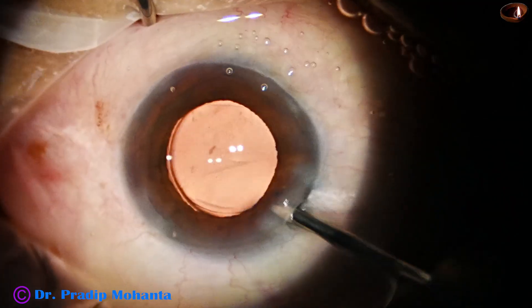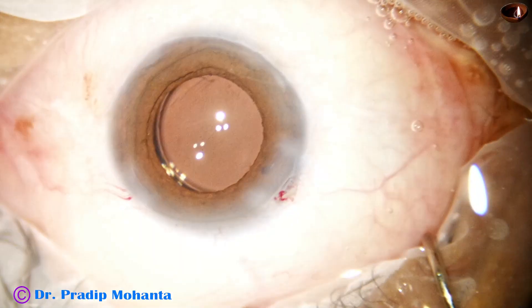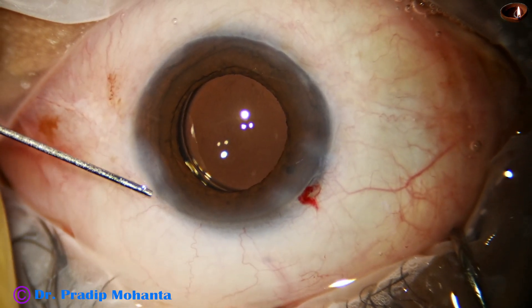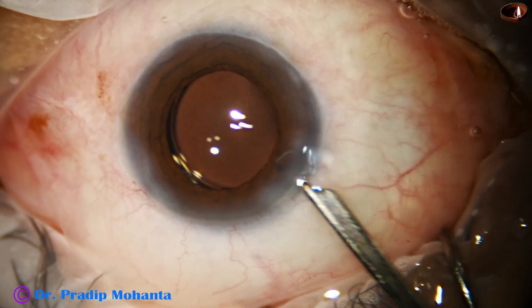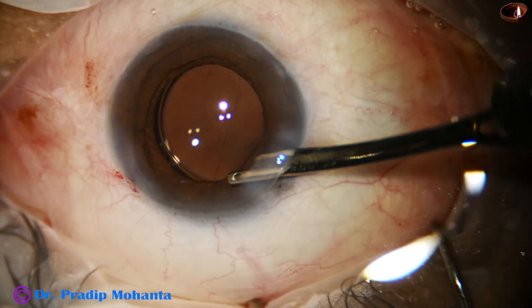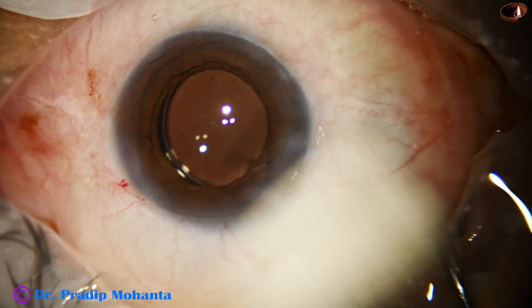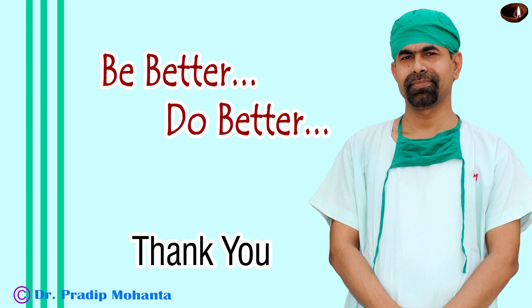So, the idea of this video is to share the concept that for mid-dilated pupils, if the cataract is grade 2 or grade 3, it is a good idea to pre-chop. Because if we try to chop the nucleus with the handpiece, sometimes the pupil becomes very small and we have to use some kind of pupil expansion ring. We can avoid that if we use this technique of pre-chopping — by the time the pupil starts to get smaller, the nucleus is already managed. We can retract the iris and remove the cortex, and use an iris hook if necessary. By this time the case is done, integrity of the wound is checked, and the case is concluded. Thank you very much for watching this real-time, unedited surgery. Hope this will encourage you to use a pre-chopper in such mid-dilated pupils.